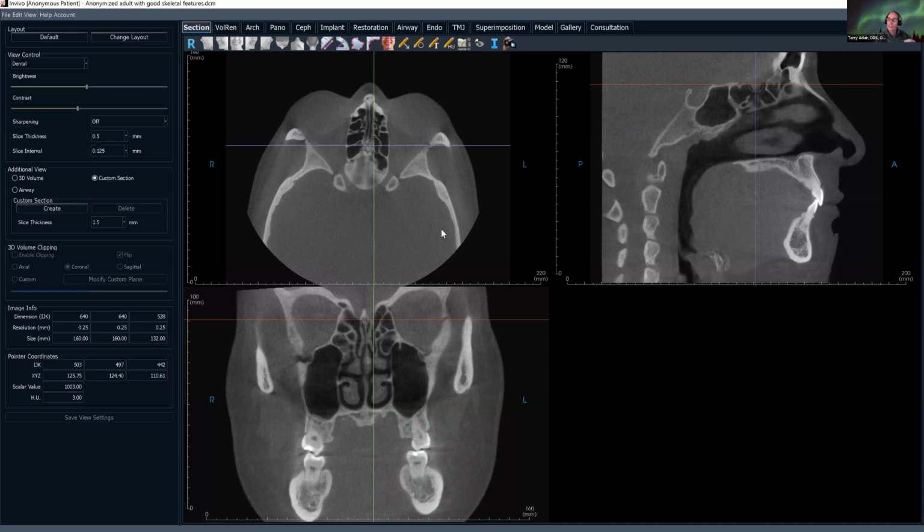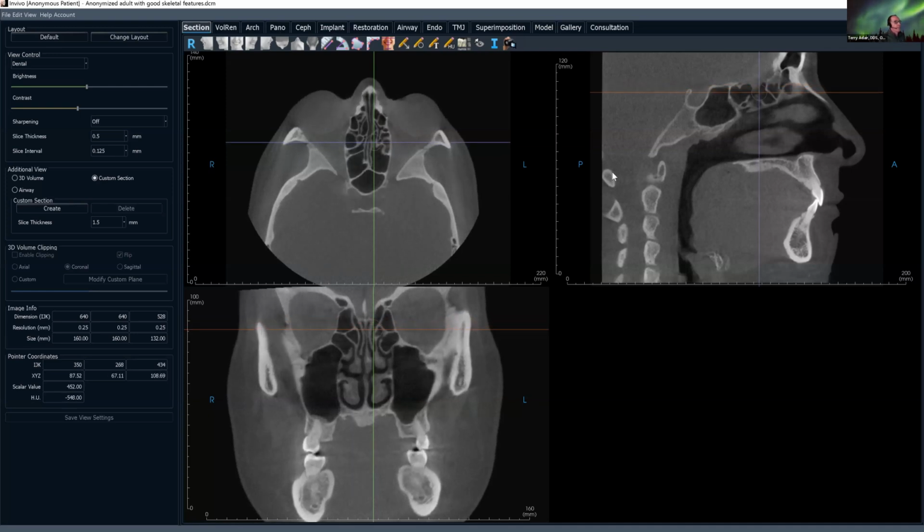The importance of these structures, again, is that you can't see the nerves and the arteries, but we're looking to see continuity. If there is disruption of the cortical borders, or if they're enlarged or irregularly shaped, it is a hint that something pathologic may be going on. As we scroll more inferiorly, the optic canals close right there. They've closed, right? The superior orbital fissures are still open. That's the term that I use. You can use whatever term or whatever prompts you as you're scrolling through this.